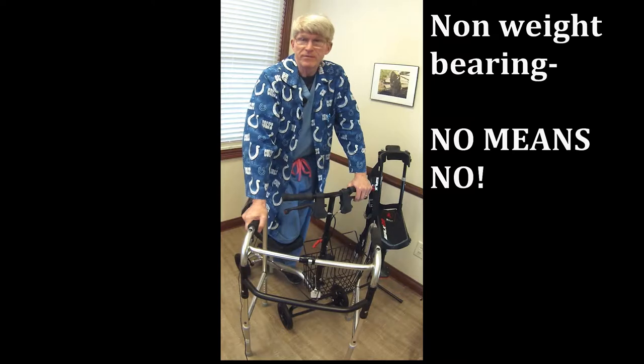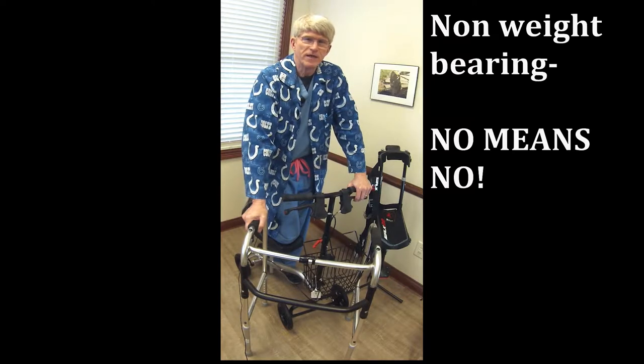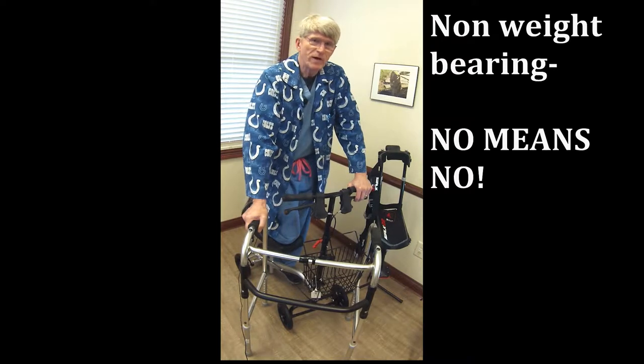Now, when we say non-weight bearing, that's typically done after surgery or an injury, and it's very important. No means no. A lot of people hear non-weight bearing and think, well, I can walk on my heel or the side of my foot. If we put a white stocking on that foot, we want it to remain white, so it doesn't lengthen your recovery time.